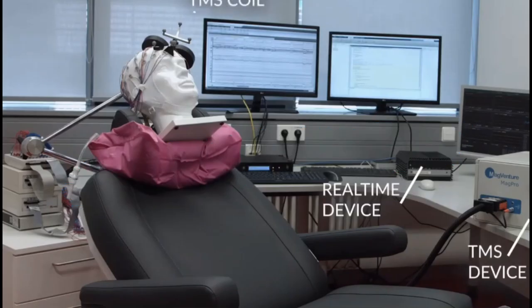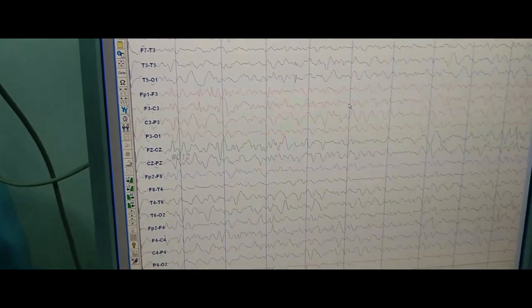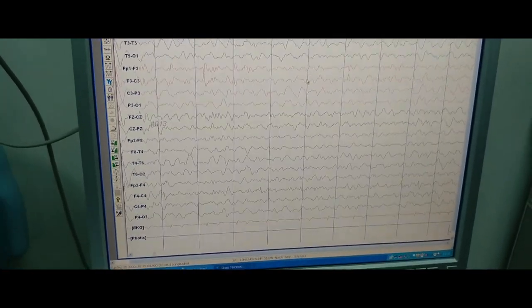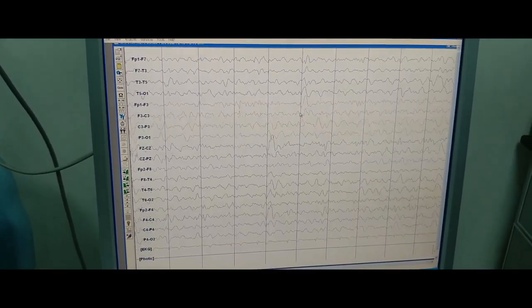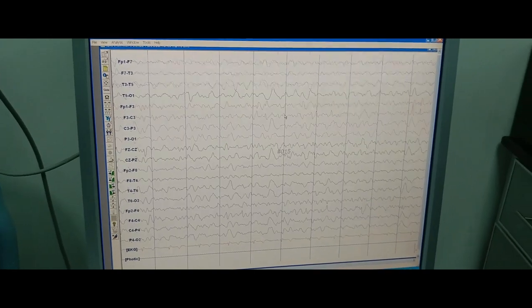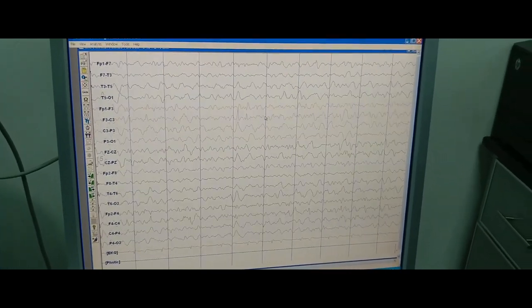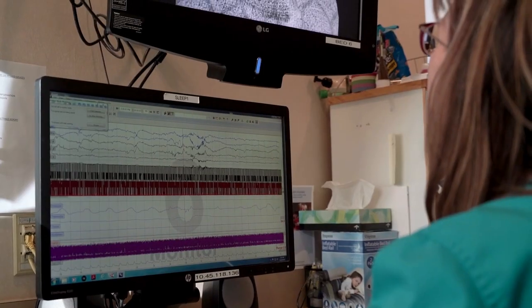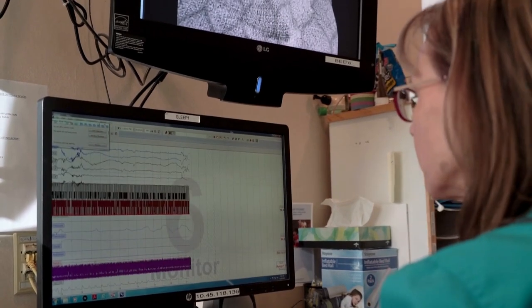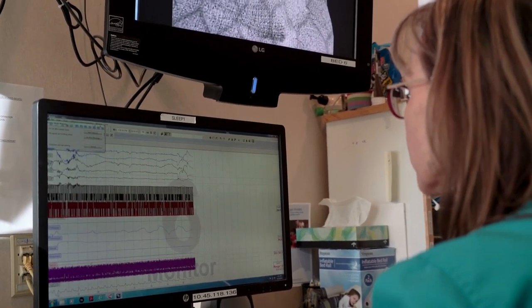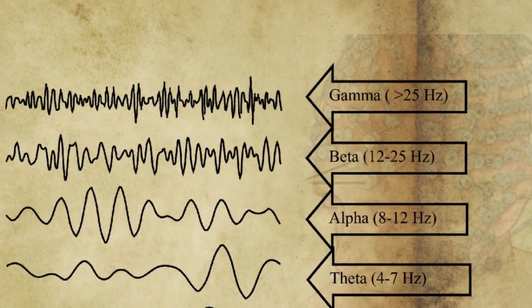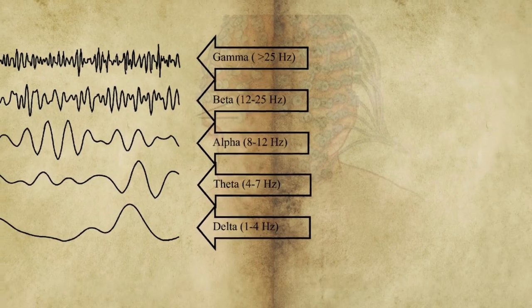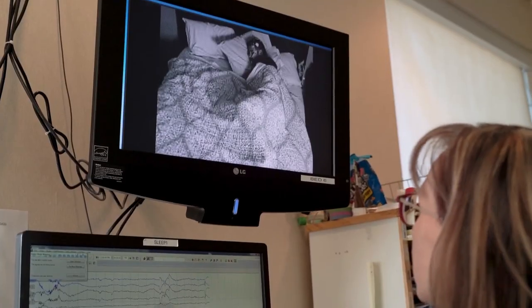EEG waveforms are generally classified according to their frequency, amplitude, and shape, as well as the sites on the scalp at which they are recorded. The most familiar classification uses EEG waveform frequency — for example, alpha, beta, theta, and delta. Let's look into these waveforms one by one.